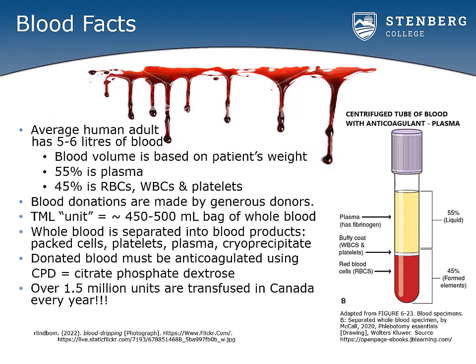Whole blood is rarely ever transfused. Instead, it's centrifuged and separated into various transfusion products. For this to happen, the blood must not be allowed to clot, so bags contain the anticoagulant CPD, or citrate phosphate dextrose. Did you know? Over 1.5 million units of blood are transfused in Canada every year. That's a lot of blood.